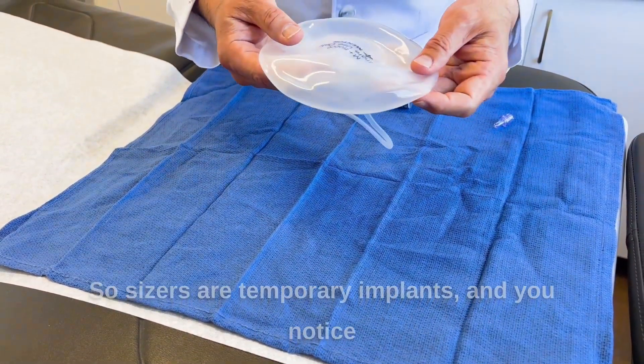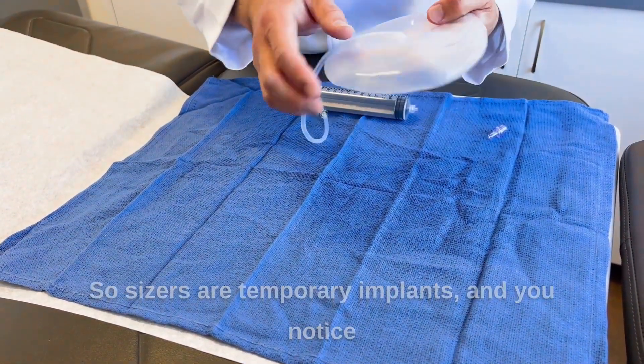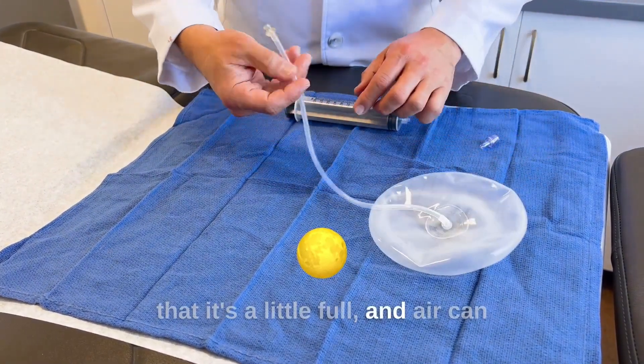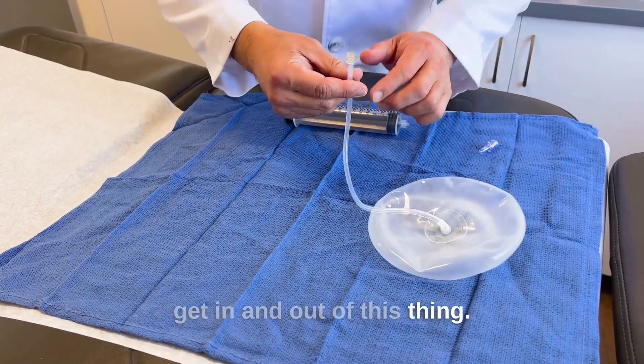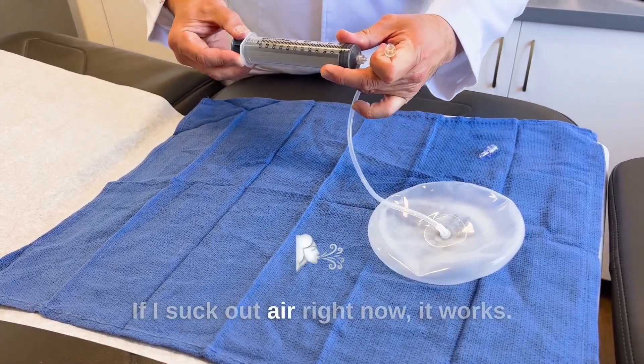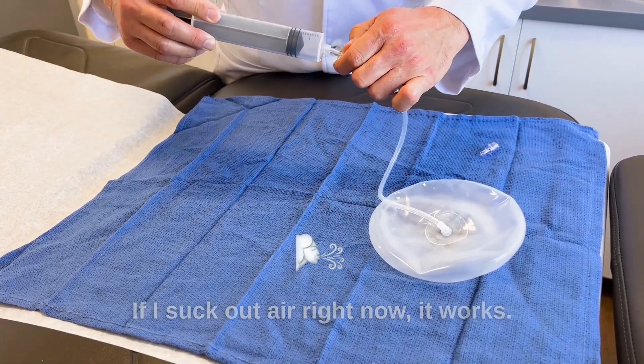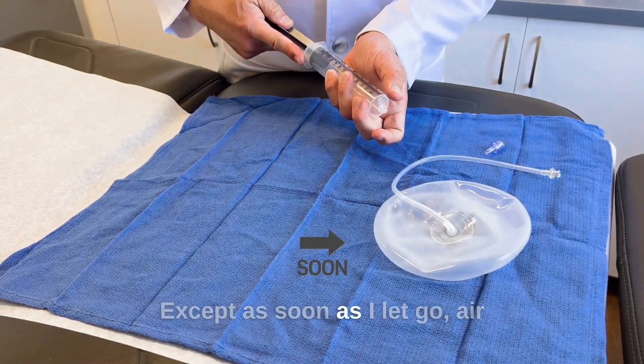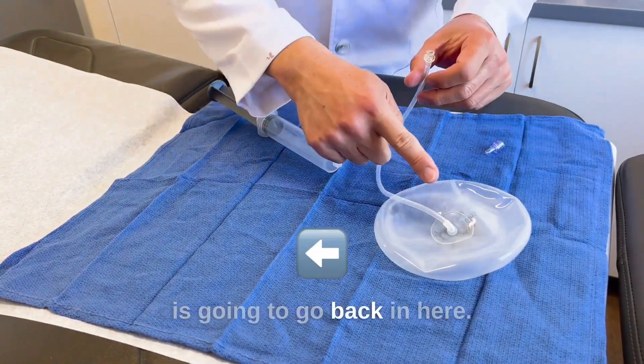Sizers are temporary implants, and you notice that it's a little full, and air can get in and out of this thing. If I suck out air right now, it works, except as soon as I let go, air is going to go back in here.